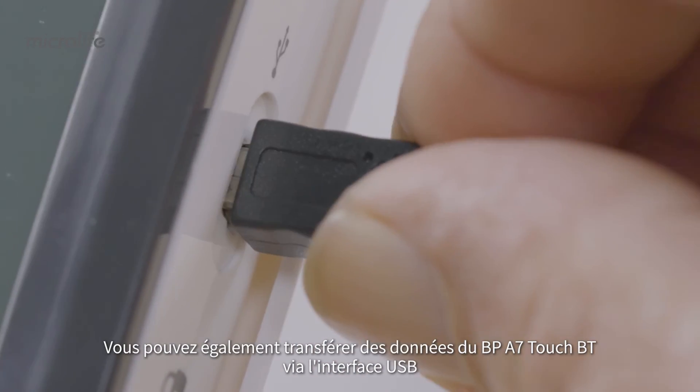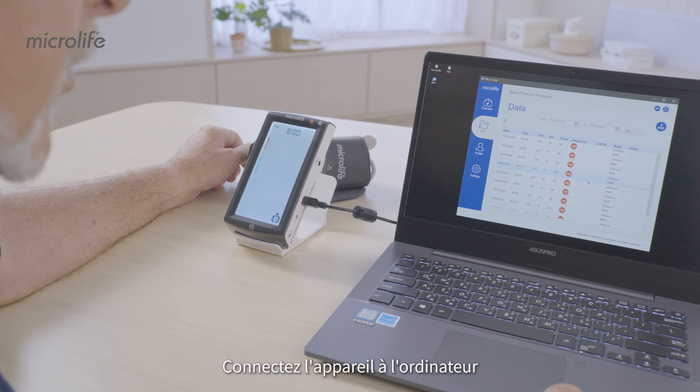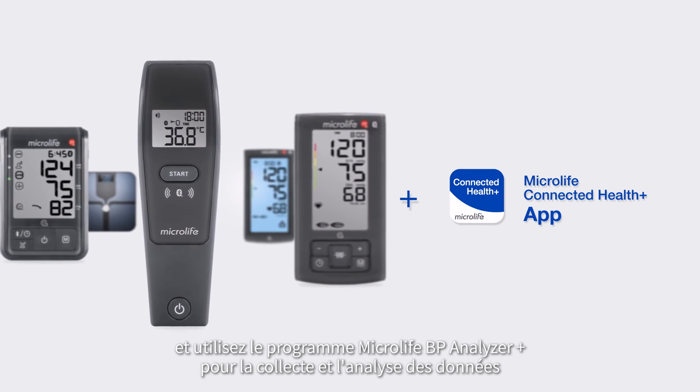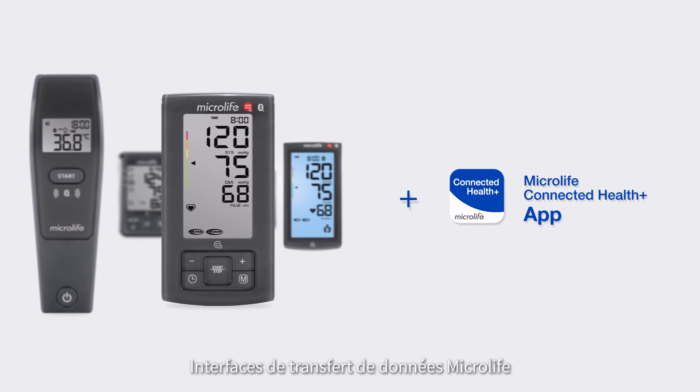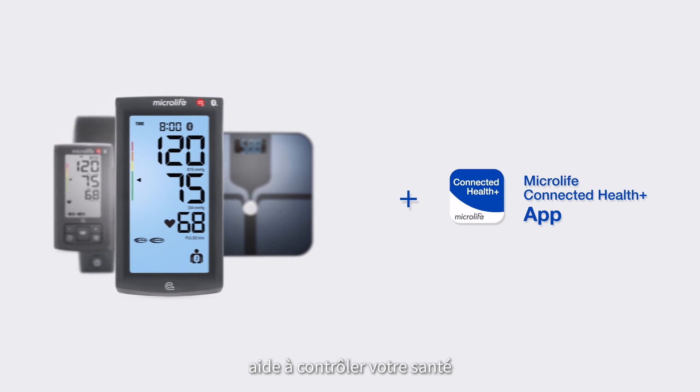BP-A7TouchBT also features USB PC link for data transfer. Connect the A7TouchBT to a PC and use the Microlife BP Analyzer Plus software to collect and review your data. Microlife's connectivity portfolio helps you keep full track of your health.